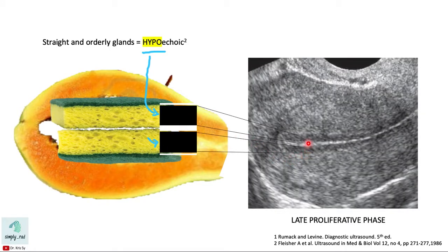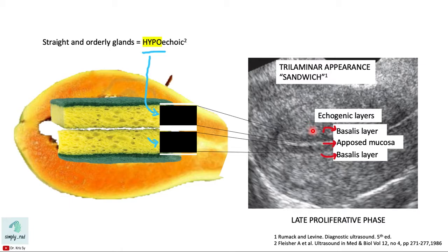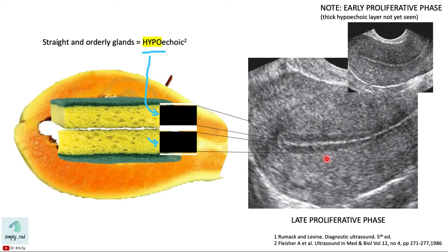You can see that there are two hypoechoic layers separated by opposed echogenic mucosal layers of the endometrial cavity. This is called the trilaminar appearance or sandwich appearance. This trilaminar appearance is composed of the opposed mucosa with the echogenic basalis layer on either side and the hypoechoic functionalis layer in between. Note that this sandwich or trilaminar appearance is seen when the functional layer is already thick, during the late proliferative phase. In the early phase, the hypoechoic layer is not yet obvious.